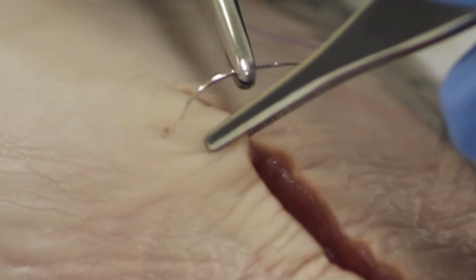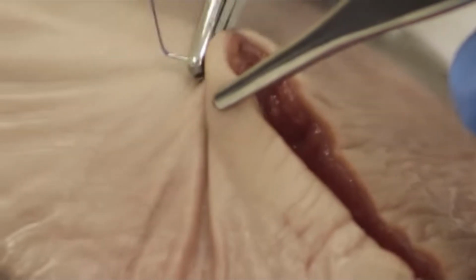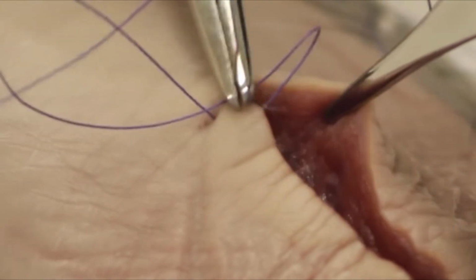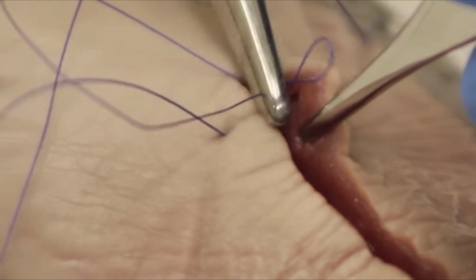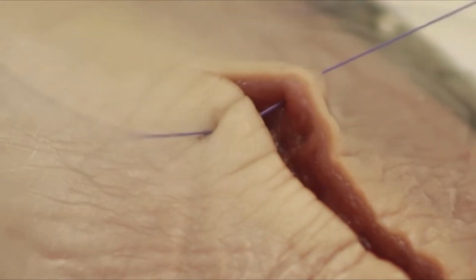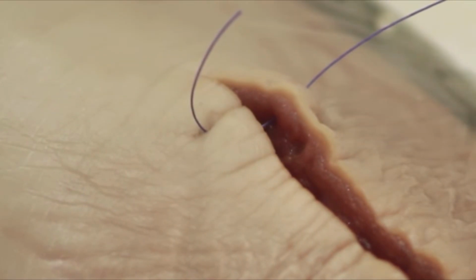Start with the first, deeper bite, often described as the far pass. Evert the first edge, then enter at about 90 degrees and drive the needle deep enough to capture strong dermis. Follow the curve of the needle through the wound and out on the opposite side. Forceps should control the tissue, but avoid grabbing the very tip of the needle. Now the needle is repositioned for the second, more superficial bite, the near pass. This is the part that creates eversion.